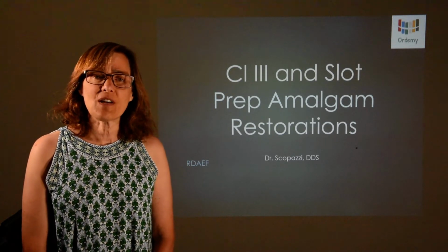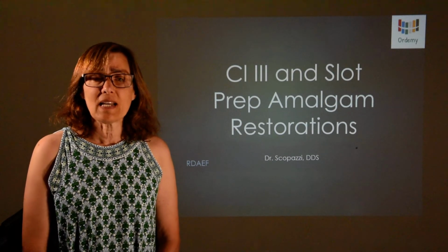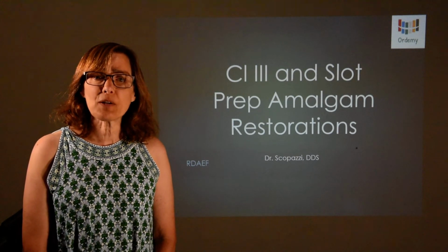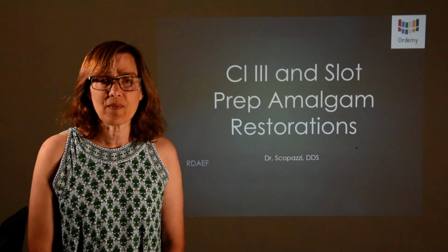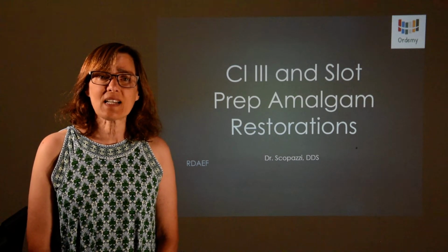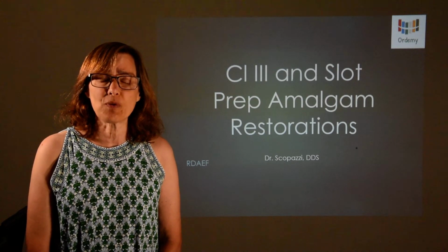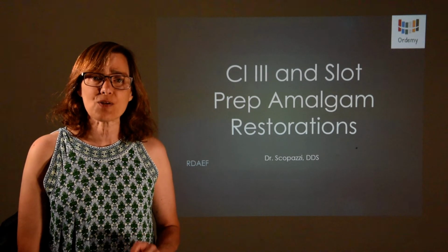The advantages of amalgam are that it's cost-effective for the patient, it's rather easily used and manipulated by the practitioner, and it can be polished over time, therefore extending the life of the restoration. The disadvantages are that it takes a specific thickness or depth, therefore tooth structure needs to be removed to a certain depth for the filling to have its strength.